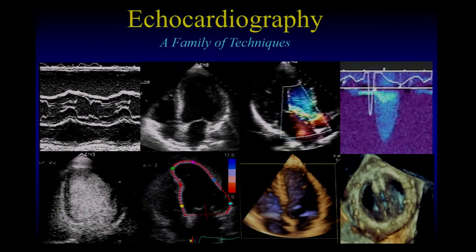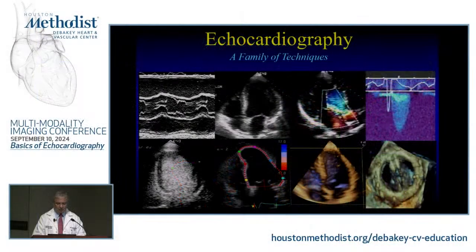It is indeed a family of techniques that are available nowadays to image the heart or any other structure, because it's certainly not for the heart only, and understand not only structure, measure function of the various chambers of the heart, and also understand flow dynamics, quantitate flow, look at valvular heart disease, regurgitation.